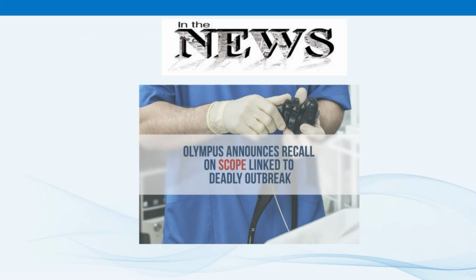And speaking of outbreaks, in 2013, 24 infections were reported in French and Dutch hospitals, prompting Olympus to alert European customers that one of its scopes could become contaminated due to a design flaw that was making it hard to clean. Now, outbreaks of infections at U.S. hospitals in L.A., Milwaukee, and Denver, and other cities followed over the next 3 years, with an outbreak of carbapenem-resistant Enterobacterales, CRE, at UCLA Medical Center that killed two patients and potentially infected about 200 others. Now, Olympus knew about this faulty scope design back in 2012, but didn't disclose the problem until February of 2015, until that outbreak of CRE at UCLA.